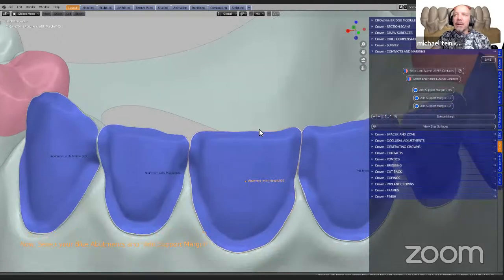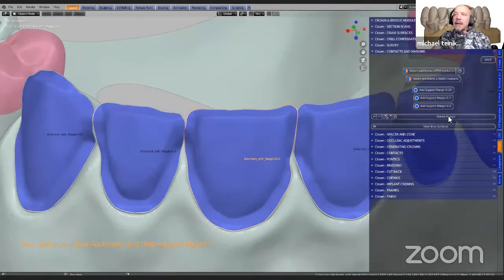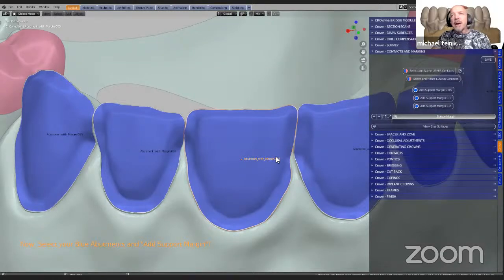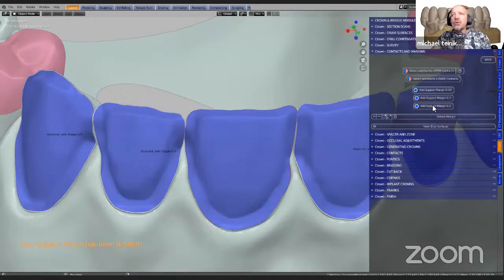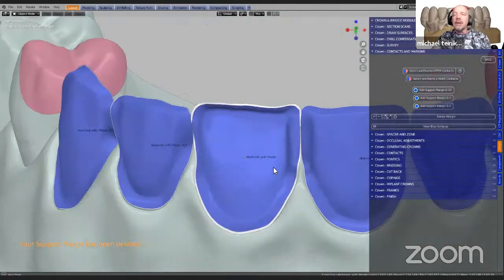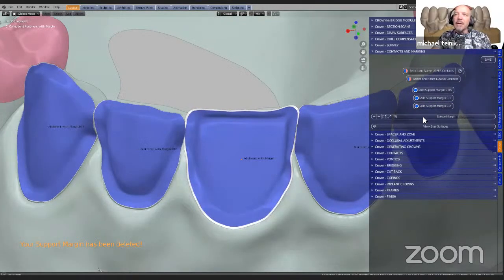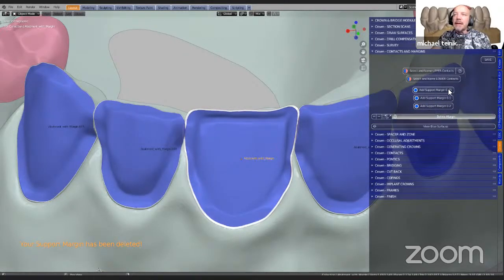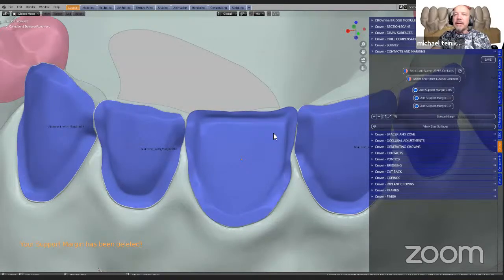If I want to delete one, I can simply click on that and say delete the margin, and I may change my mind — I want a 200 micron margin. Here we've got a bigger margin. So we're going to delete this again and select the smaller margin.